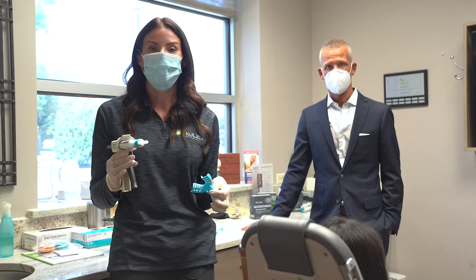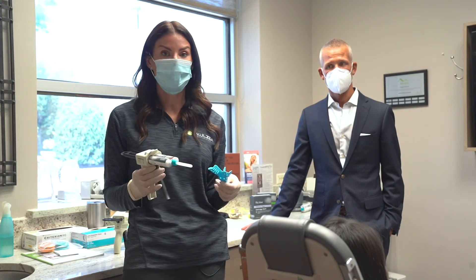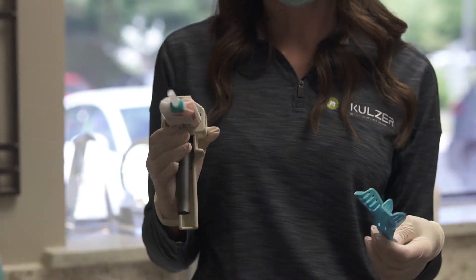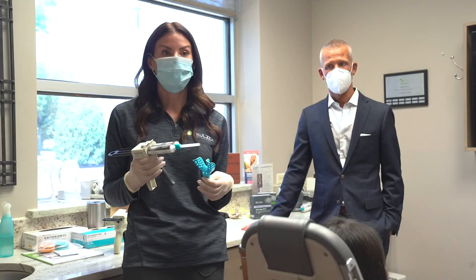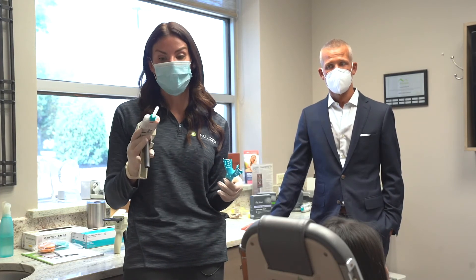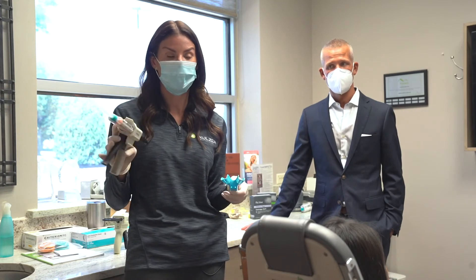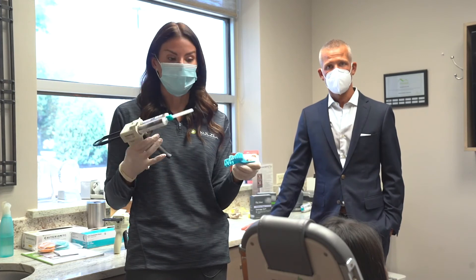The next impression we're going to review is for a night guard or mouth guard. Today we're using Xanasil, which is an alginate substitute — still a silicone material. I call this the assistant's best friend because it's a one-step process; you only need one viscosity, which is a medium viscosity.